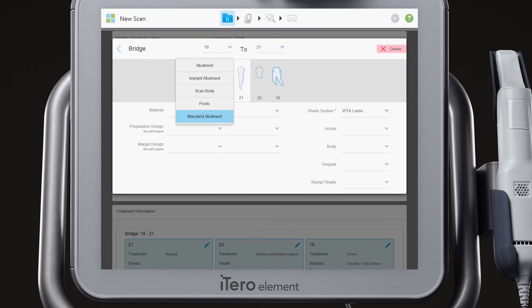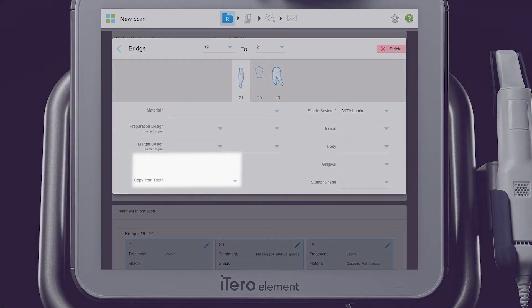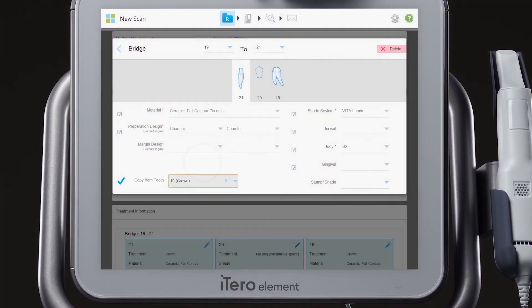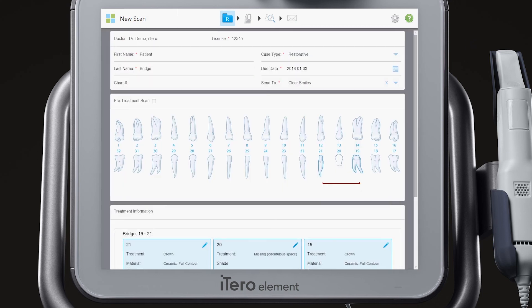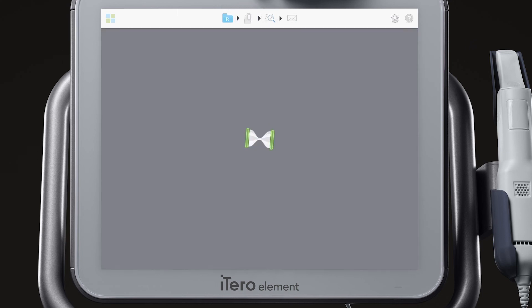For each unit in the bridge, you can copy the attributes of another unit within the bridge. Next, tap the Scan icon and scan according to the restorative scanning protocol.